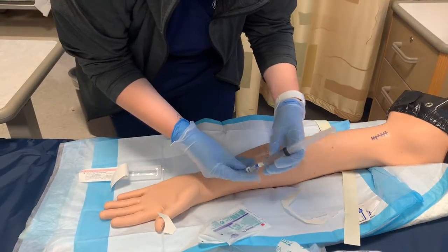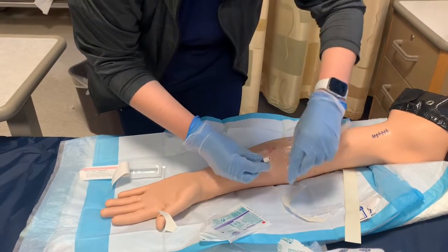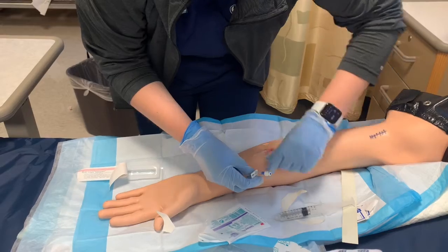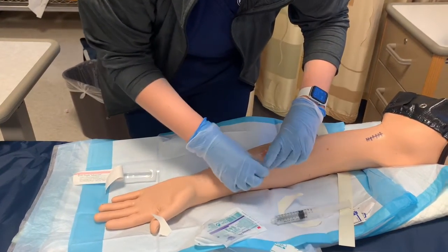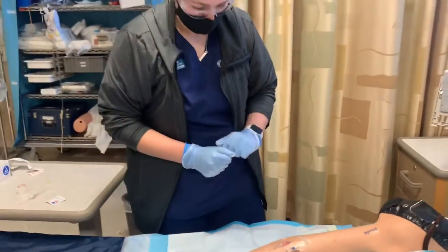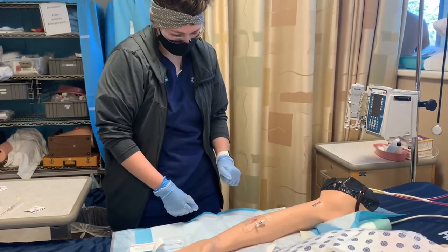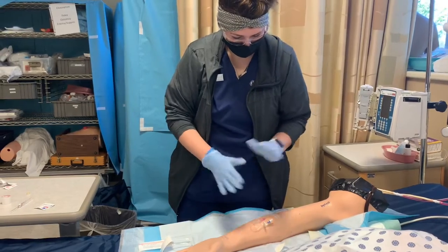Okay, I know this flushes, so I can saline lock this. And tape that down to avoid it getting caught on any clothing or bed sheets or anything. Okay. So the arm looks good, it flushes, she's not complaining of any pain, it's patent. So then, we're all good.